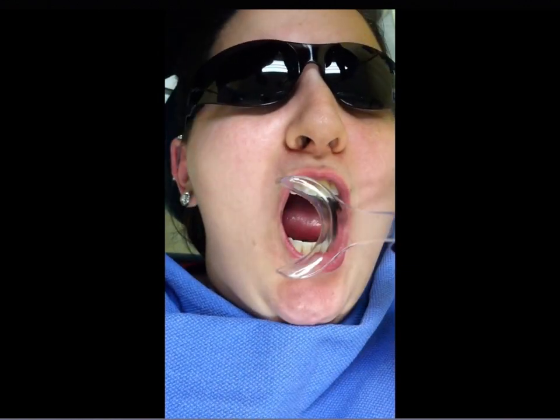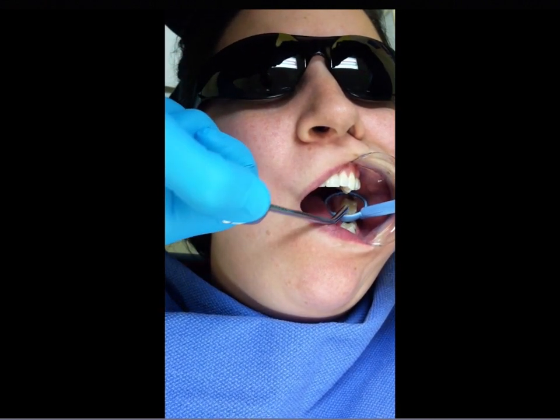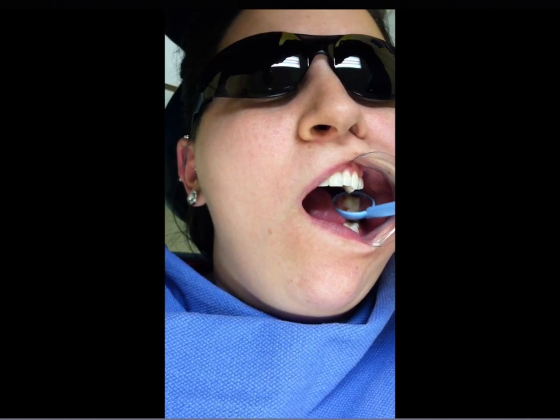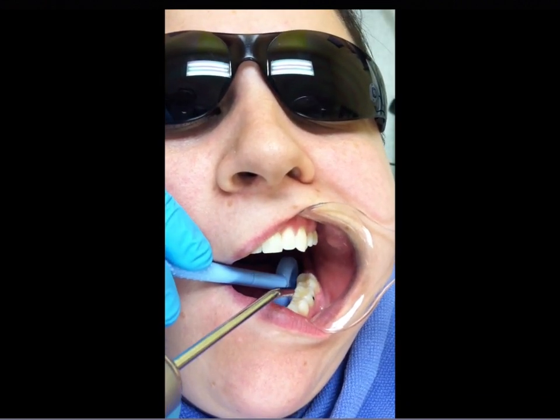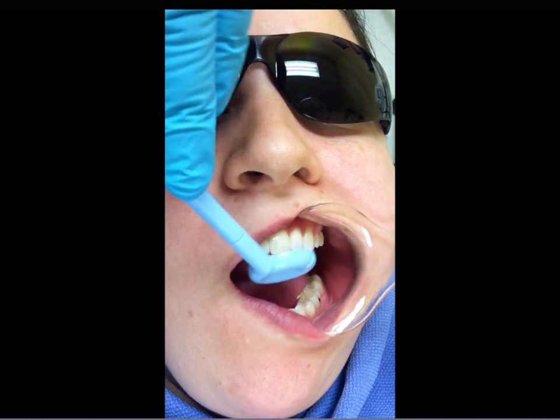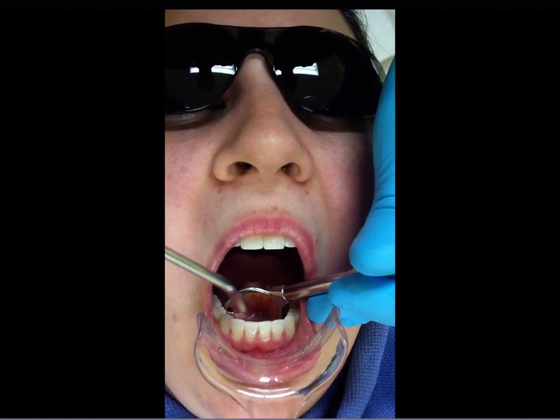Obviously you don't need the cheek retractor when you're working on a patient. Here in this position, the New Bird's holes on the face work really well because on this particular patient it's not an issue, but a lot of times the tissue will get sucked up into the suction holes and you'll have no suction. With the New Bird, you're always going to have suction, especially in that position. Here it's attached to the HVE suction — you get a lot of power.